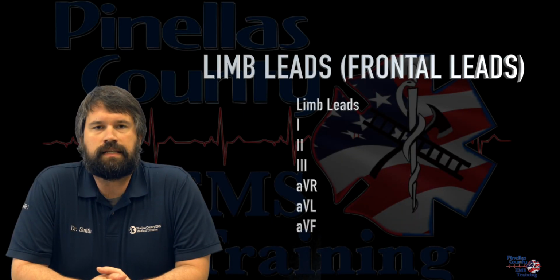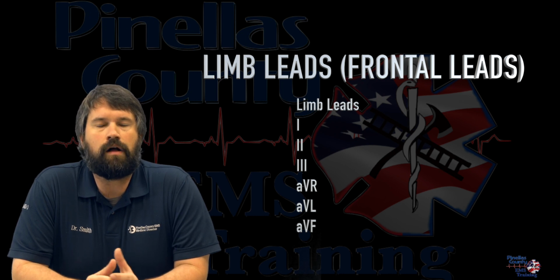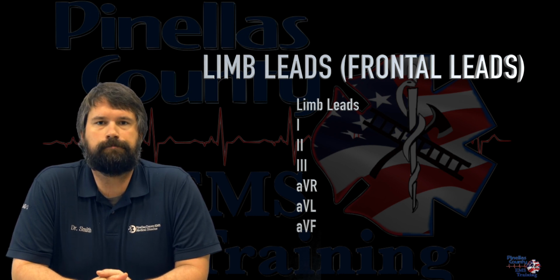And this is a list of the 6 limb leads. Obviously, these are placed on the limbs, and in conjunction with the precordial leads, they allow us to get all 12 tracings of your standard EKG.